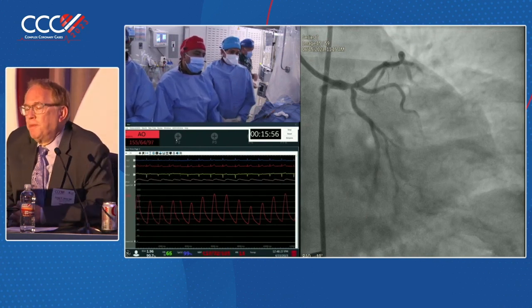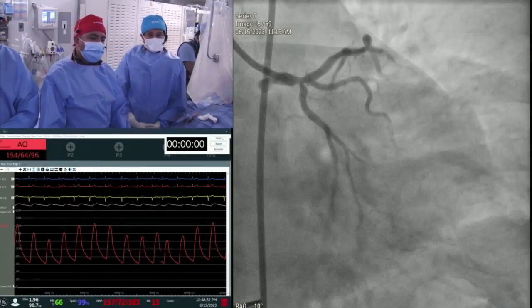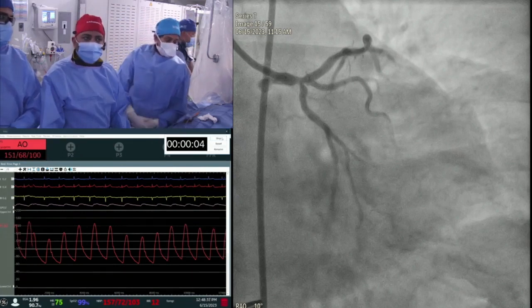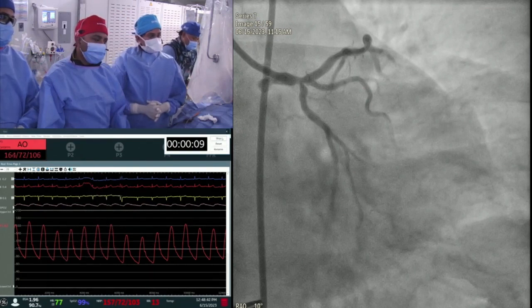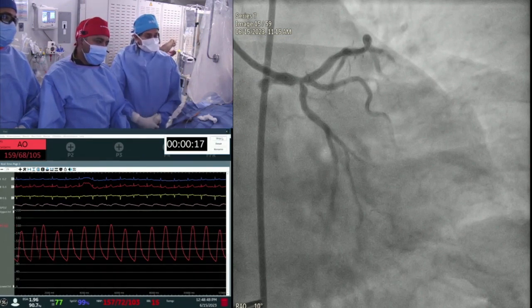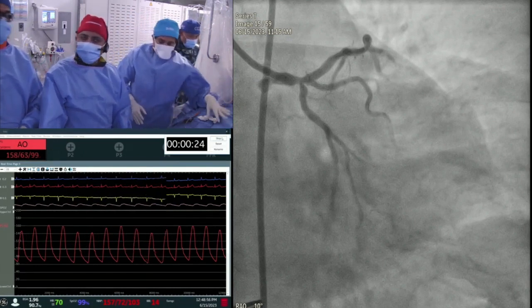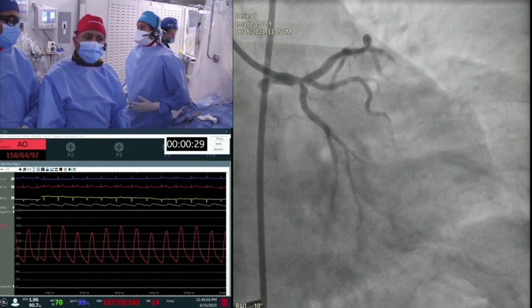All right. Dr. Kinney, what's your plan? So we will image both the left main to LAD as well as left main to circumflex, but without imaging, the question is what is called a knuckle stent, where you just place a stent in the distal left main. So the trifurcations, you do not touch at all. But once we image, let's see how else we can change it. Could we do a provisional from left main to LAD, but definitely no 3 wires. Okay, let's see. All right, let's have a look at your imaging.